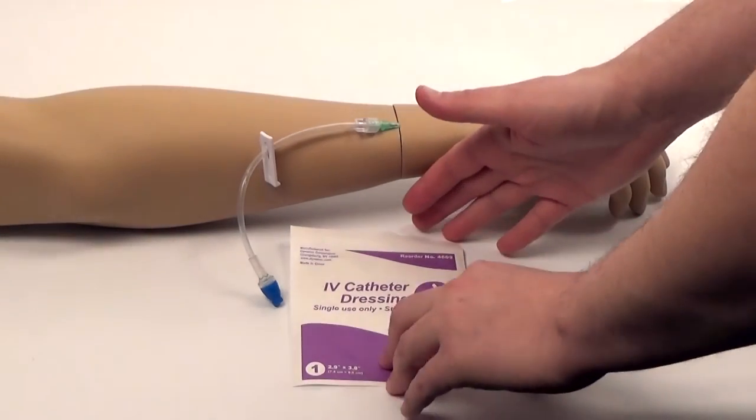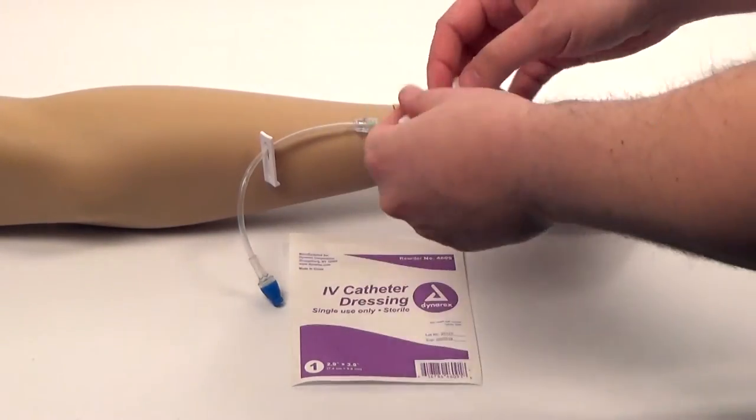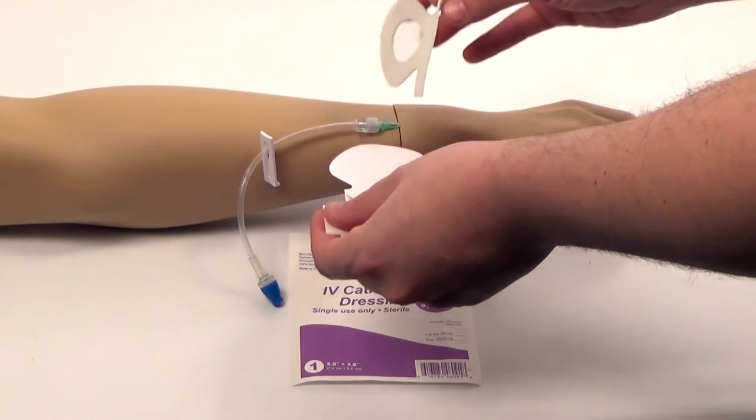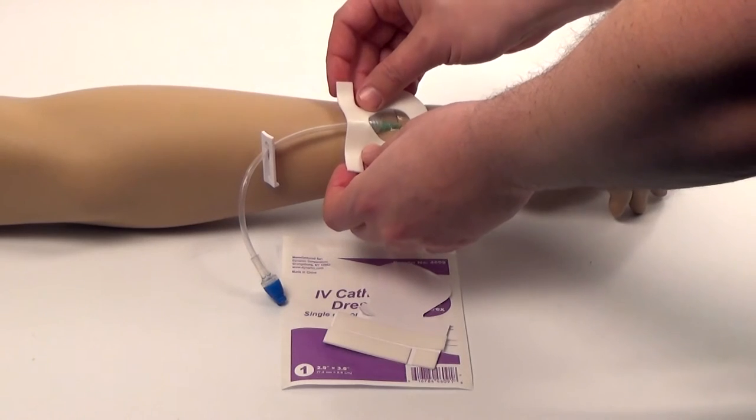Let me show you how the IV catheter dressing works. Pull the catheter dressing out of the package, gently remove the dressing off the paper, and apply it to the site where the IV was placed.